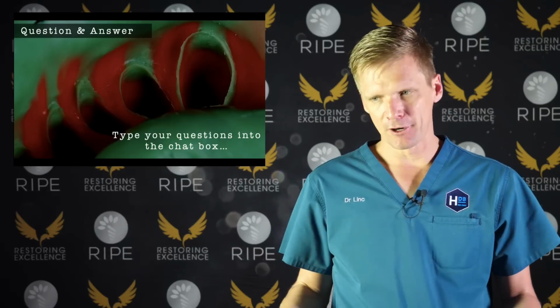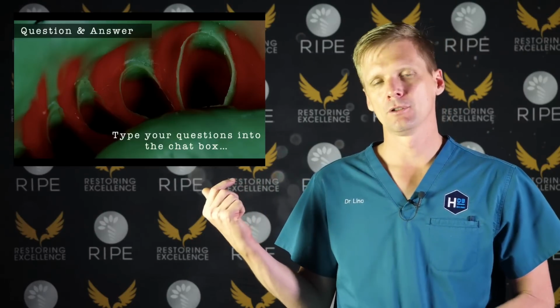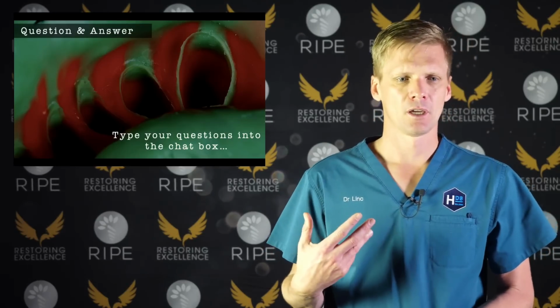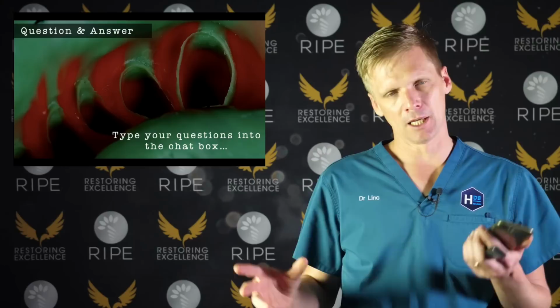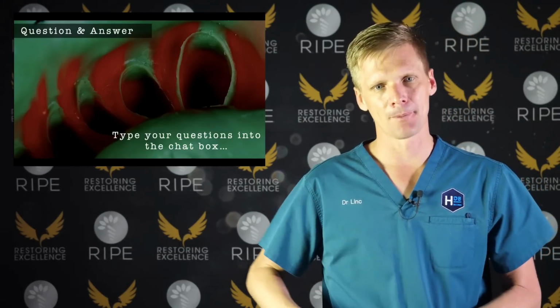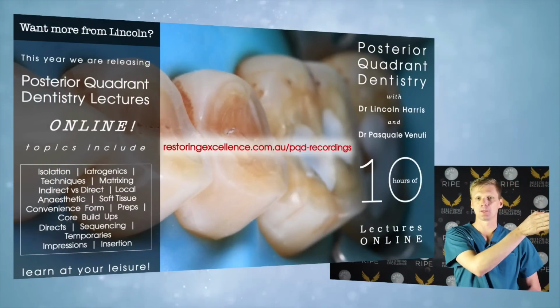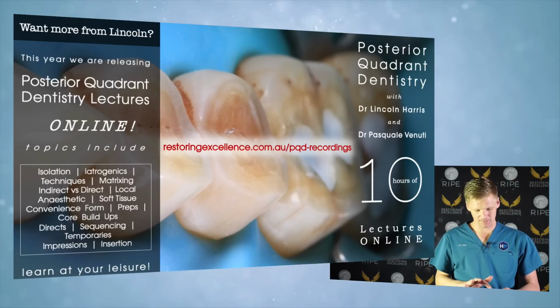Okay. Now, as far as whether you take single step or 2-step, I don't really care. It's whatever you are comfortable with and have done a lot. I have friends who have only ever done 2-step impressions, so they take a putty impression and then they reline it. There's people who say there are studies that show that it's not as accurate. Those studies are in vitro, they're not in vivo. So, I know good dentists who do it both ways. I always take single step because theoretically I like both my silicones set at the same time because then I don't get so much distortion, but that's theoretical and we can't say that that actually makes any difference to the clinical outcome. I don't think that whether it's 1-step or 2-step makes any difference. What matters, as you noticed with this presentation, is things like having enough time, polishing your preps, doing nice core build-ups, fat cord to push the tissue away. Those things matter. How you put the silicone on doesn't matter so much.